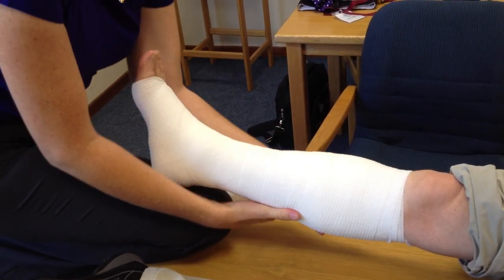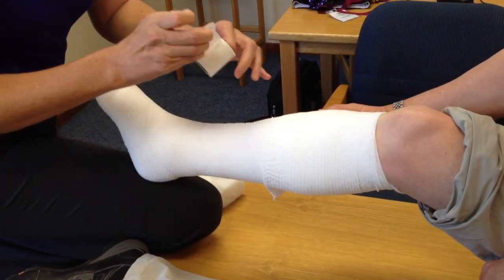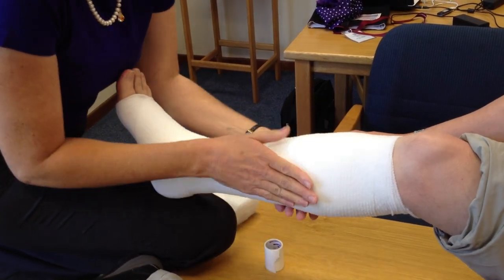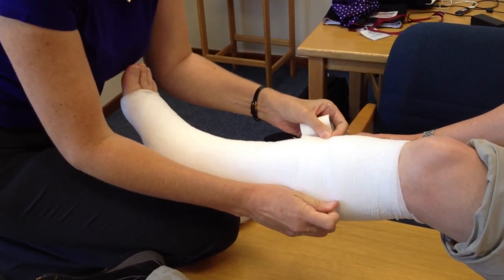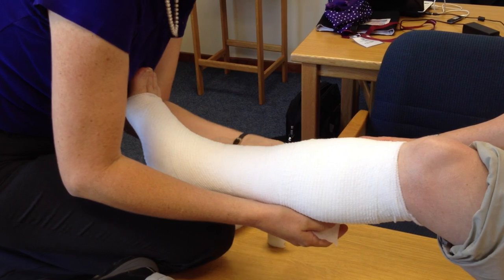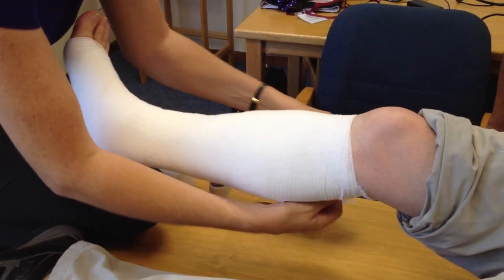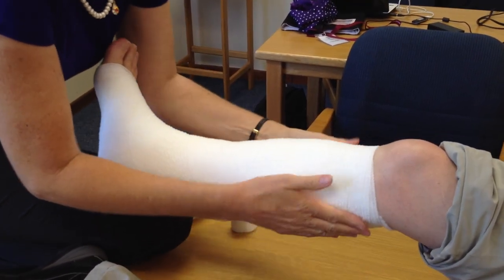Again, tape it down — and there is the system. No added pressure when taping this down. Don't pull the tape tight when securing a bandage. Notice the length of tape being applied and that it is secured in two or three places and not circumferential.